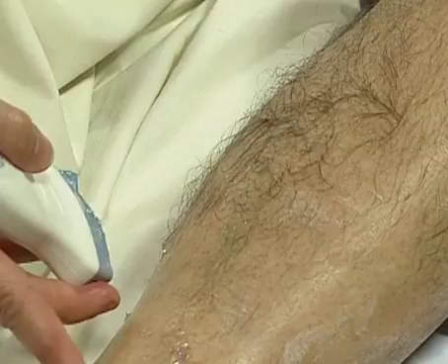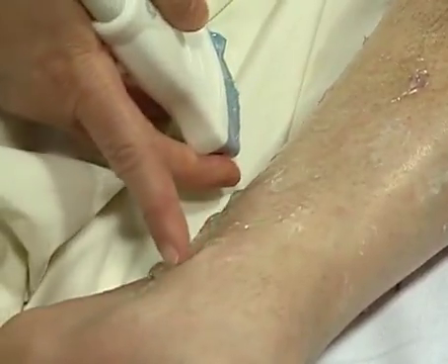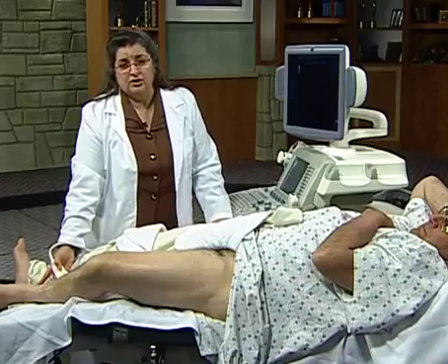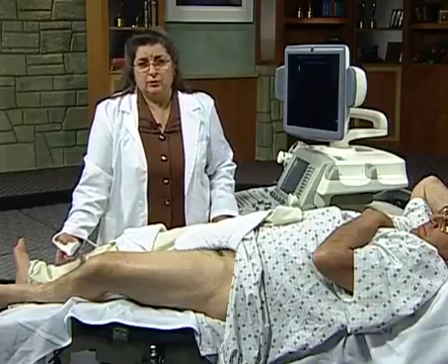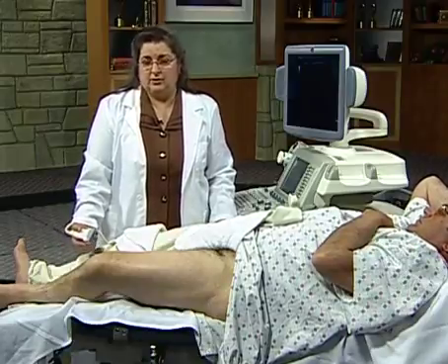If we want, we can also follow that posterior tibial artery distally behind the ankle down here, where it goes down and feeds into the pedal vessels of the foot. Now that we've done this, I'm going to change the position of the patient and approach the more posterior lateral aspect of the calf so I can see the peroneal arteries and the anterior tibial artery.